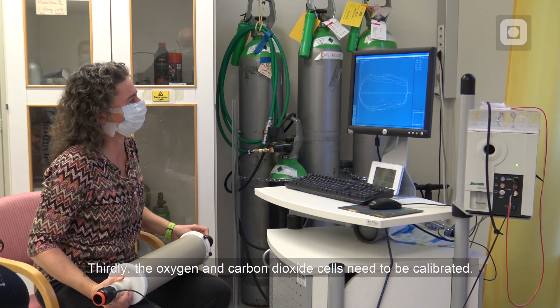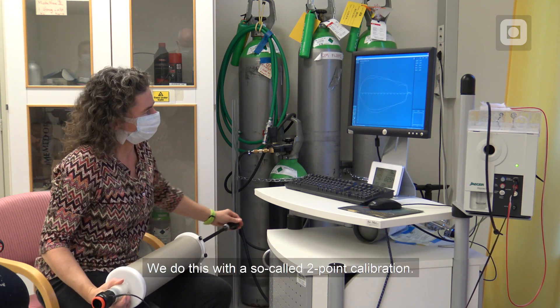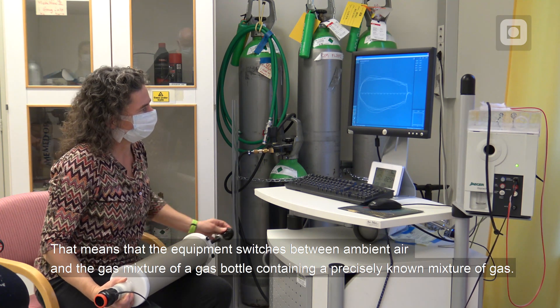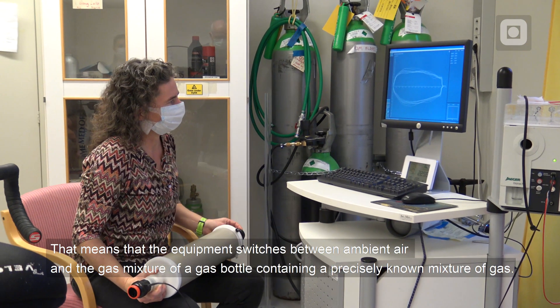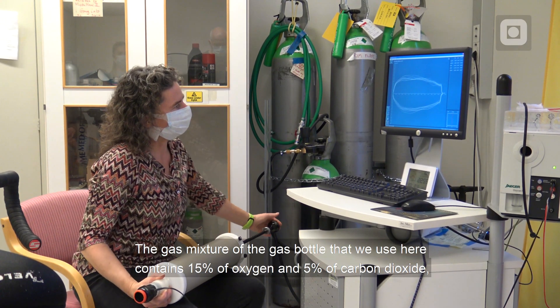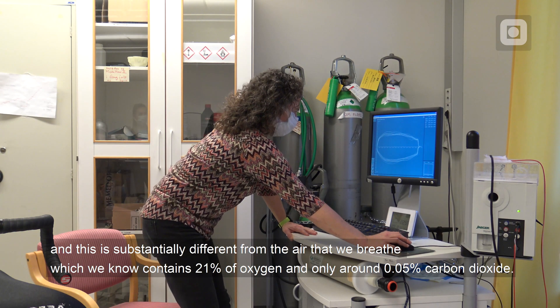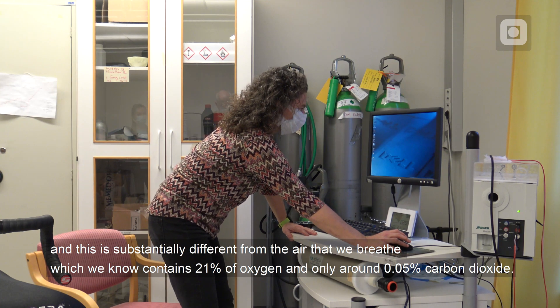Thirdly, the oxygen and carbon dioxide cells need to be calibrated. We do this with a so-called two-point calibration, meaning the equipment switches between ambient air and the gas mixture of a gas bottle containing a precisely known mixture of gas. The gas bottle we use here contains 15% oxygen and 5% carbon dioxide, which is substantially different from the air we breathe, containing around 21% oxygen and only around 0.05% carbon dioxide.